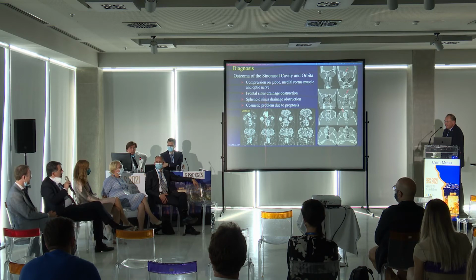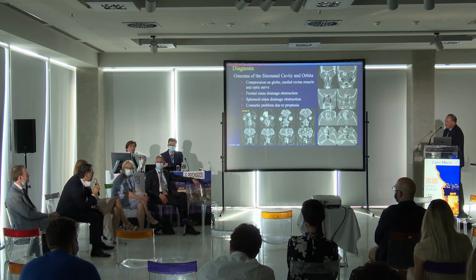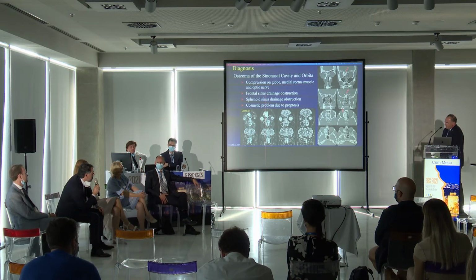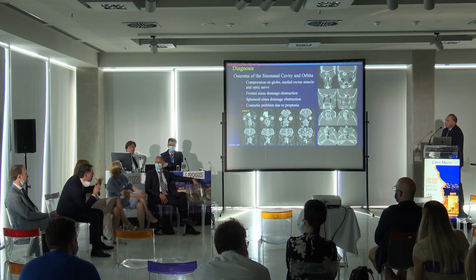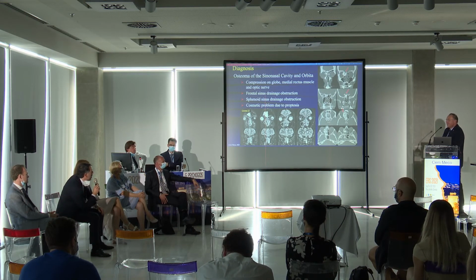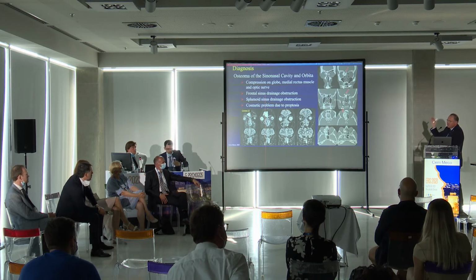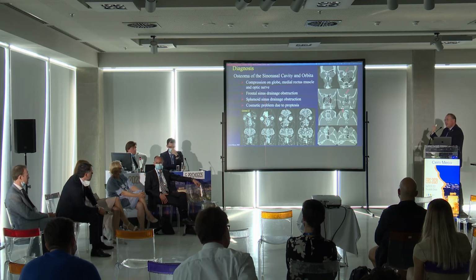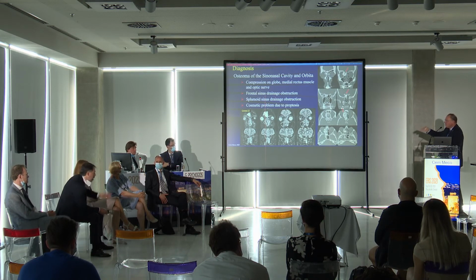Exactly. I would like to ask you one thing. It's not this case, but sometimes you have the attachment at the lateral lamella of the cribriform plate, which is very fragile and a site of CSF leak. Do you think it's acceptable to leave a small piece at this site, or do you have to drill and repair the CSF leak? Very good point. It's like the case that Zuzana showed. Where it is dangerous, for such a benign disease, I try to leave some. My intention in this case was also to make it thin and leave some portion there. But as I made it thinner, as in the case you have seen, it started to move by itself.